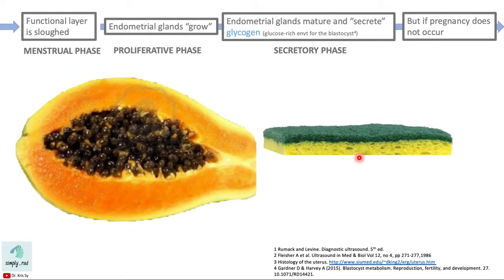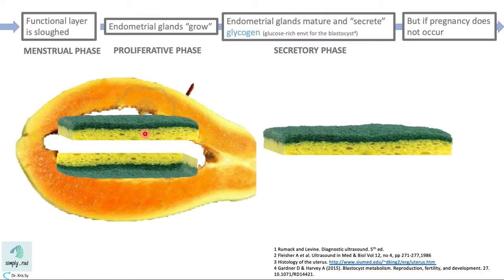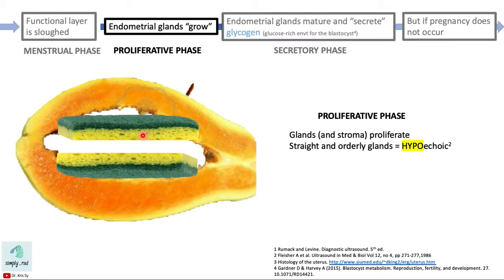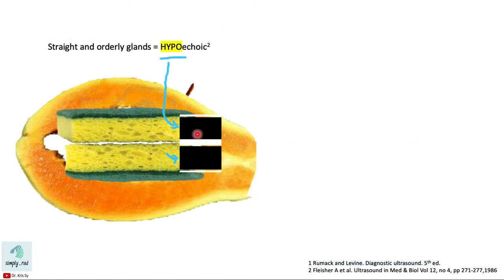Here's the endometrium lining the uterus, with a layer in the anterior wall and another in the posterior wall. We start with the endometrium appearing very thin, because the functional layer has just been shed during menstruation. The glands then proliferate — hence called the proliferative phase — creating a straight and orderly pattern of glands in the functionalis layer. Because this layer has straight and orderly glands, this layer will be hypoechoic, meaning it's darker compared to the myometrium.